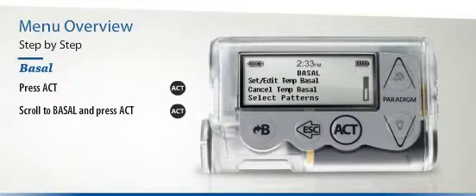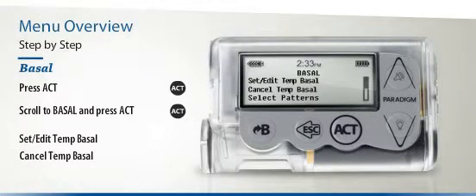You will now see the basal menu. Depending on which functions are active, this will include Set Edit Temp Basal, Cancel Temp Basal, Select Patterns, and many more.